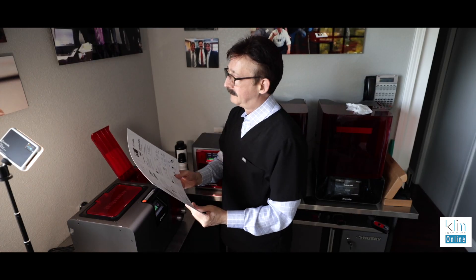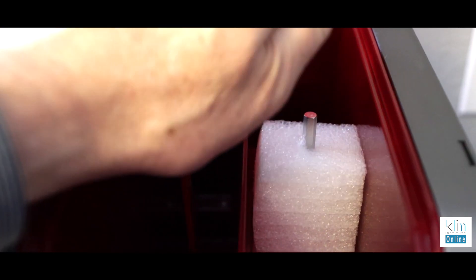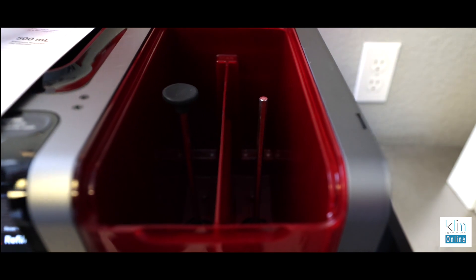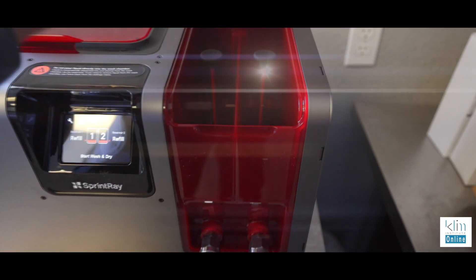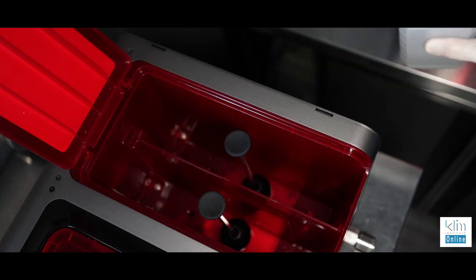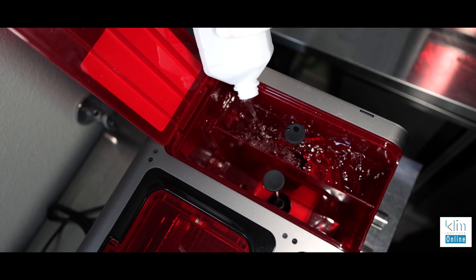The instructions for setting up the Pro Wash & Dry are really simple. You unpack and remove any internal supports, and then you fill the reservoirs. There are two reservoirs, and you want to use 91% up to 99% isopropyl alcohol in both of them.